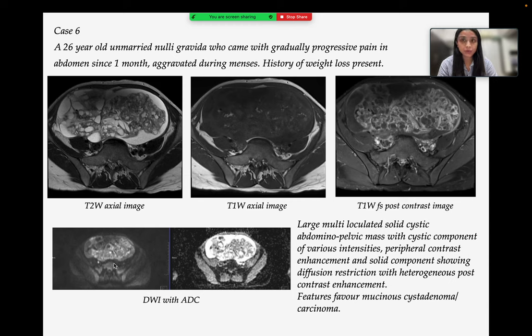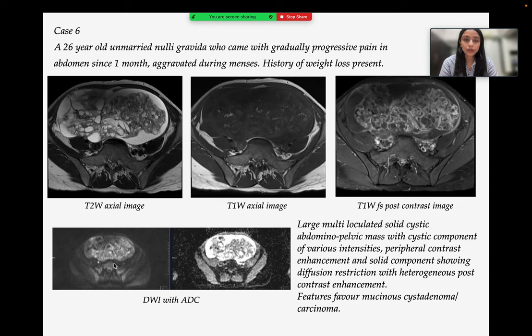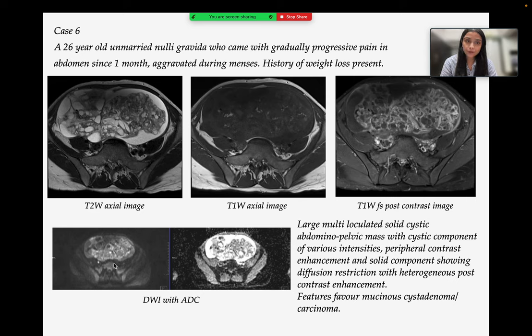Case 6 is a 26-year-old unmarried nulligravida who presented with gradually progressive pain in abdomen since 1 month, aggravated during menses, with a history of weight loss. Images show a large multiloculated solid cystic abdominopelvic mass with solid components of various intensities, peripheral contrast enhancement, and solid component showing diffusion restriction and heterogeneous post-contrast enhancement. Features favor mucinous cyst adenocarcinoma.